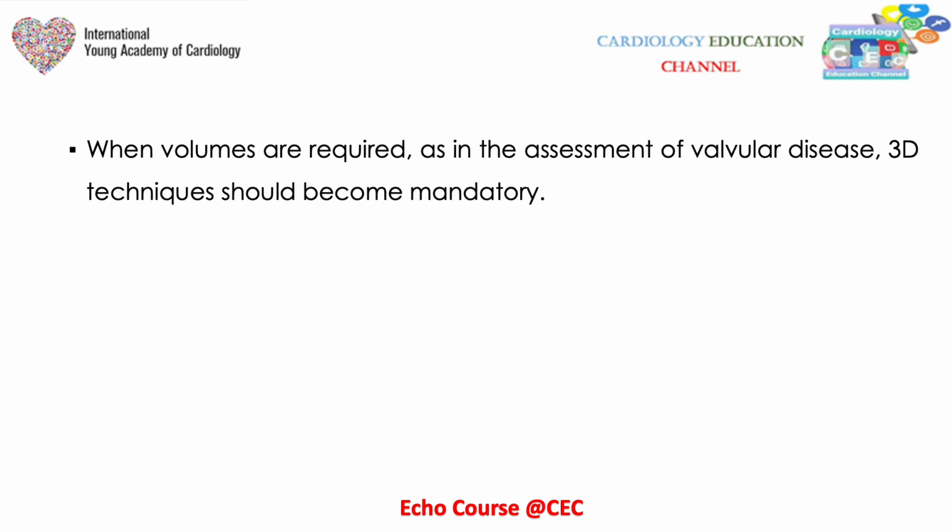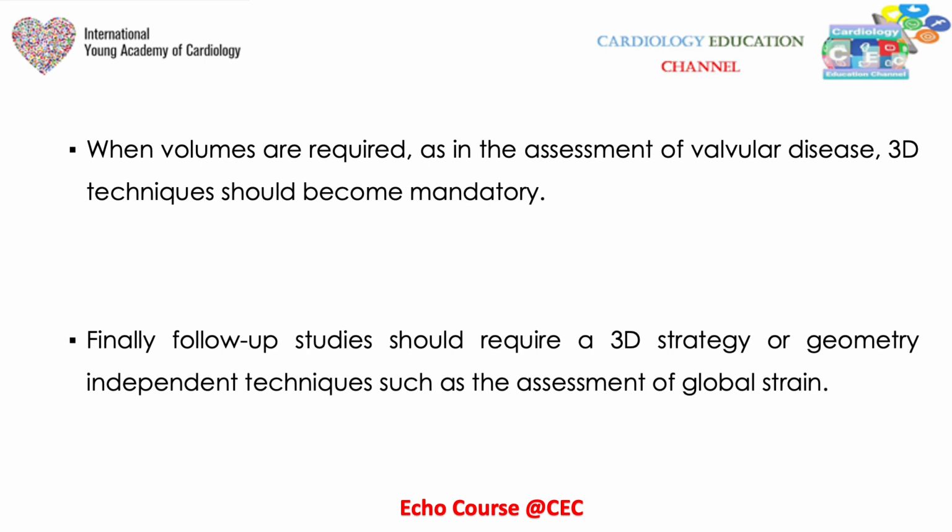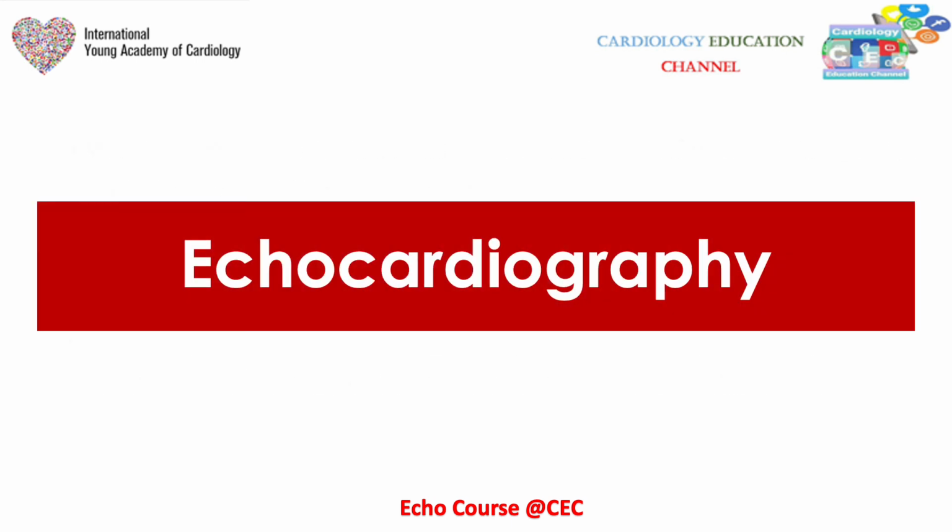We should also stress that when volumes are required, as in the assessment of valvular diseases, 3D techniques should become mandatory, especially if the left ventricle is disfigured and out of the normal geometry. And finally, follow-up studies should require a 3D strategy or geometry-independent techniques such as assessment of the strain.